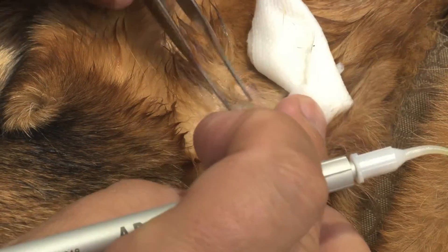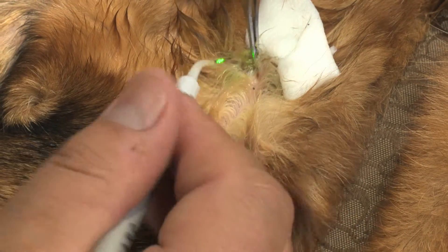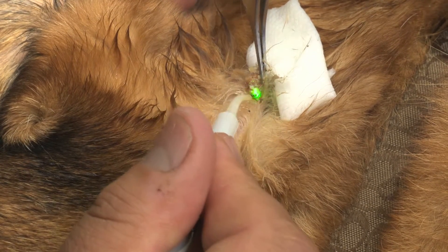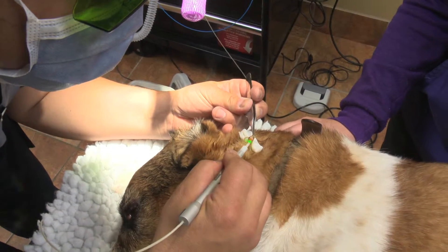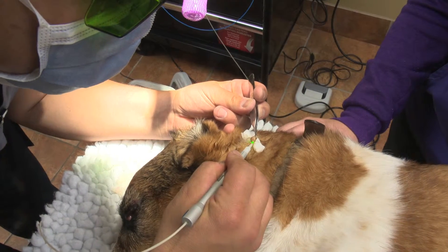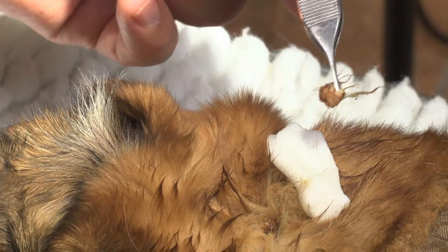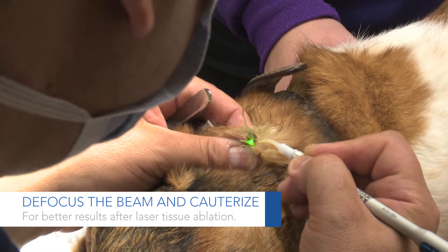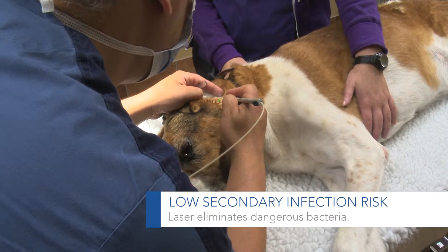I'm going to just take my forceps and lift it up. If you're thinking about doing histopath on these lesions, you can still submit it. The only thing is that the margins you're looking at are going to have been cauterized. We're going to go ahead and ablate the base of it — there's a good chance that in most cases we'll actually get rid of any germinal cells, or neoplastic cells, that might be there.